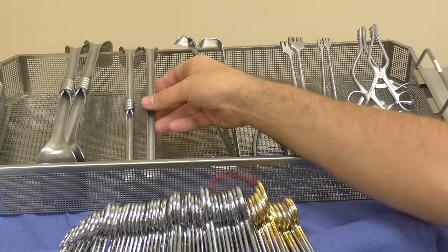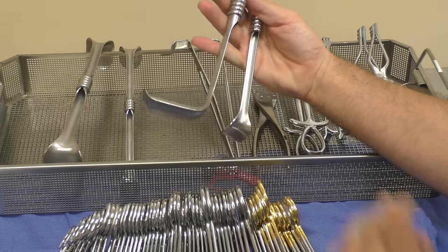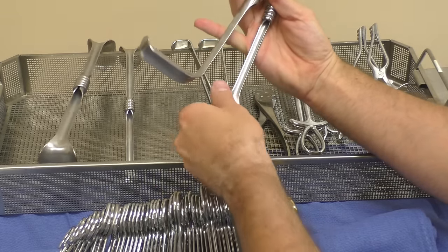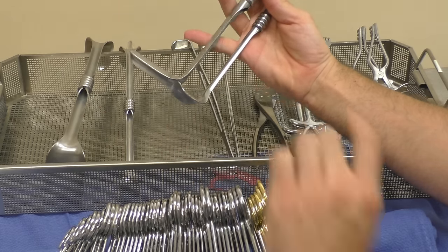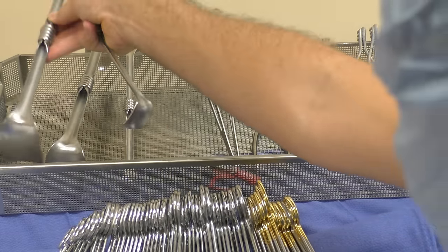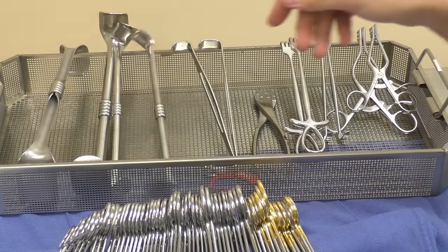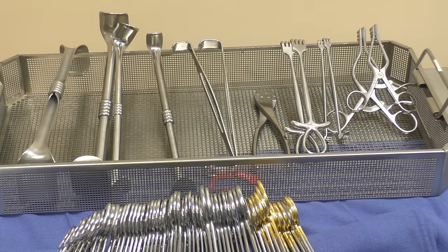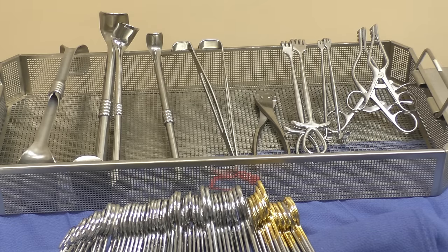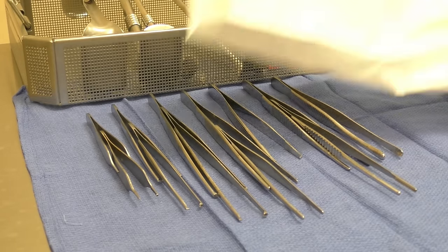And the last two here are the Richardson retractors. We got a small one and we've got a big one. You'll know it's a Richardson because it's always going to kind of come back on itself a little bit at the tip, as both of these do. And those are just, again, a good general use retractor for a multitude of things in a multitude of cases across the board as far as minor cases go.